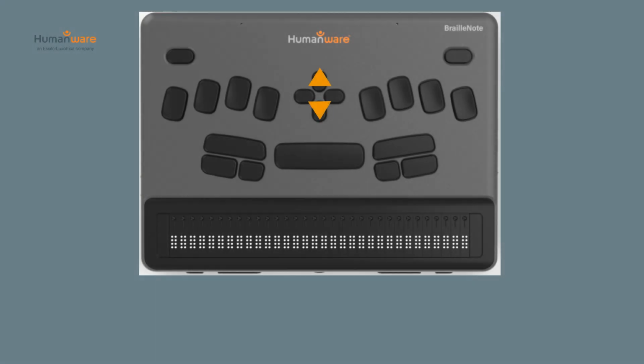They're conveniently positioned right in the middle of your device, making navigation a breeze. Another method to perform the same action is by using the two outer thumb keys, which are located at the front edge. The last thumb key on the right, also known as the next key, will move you forward, and the thumb key to the far left, also known as the previous key, will take you backward. So, there are many different ways to perform one type of navigation.